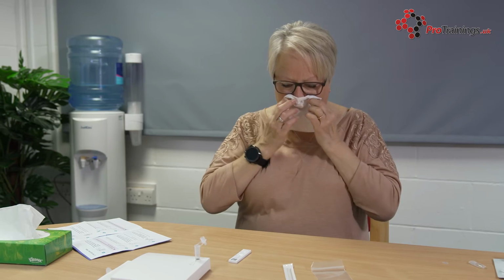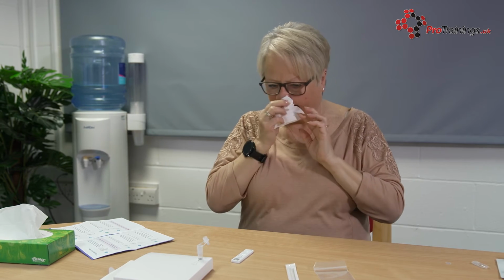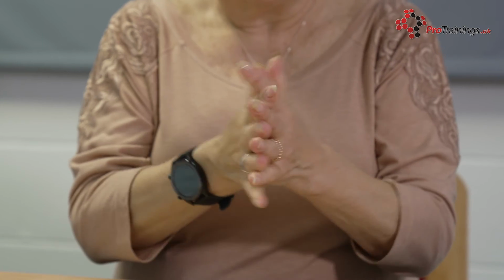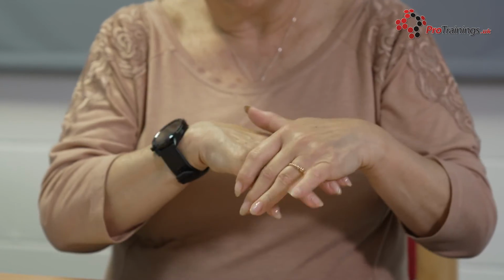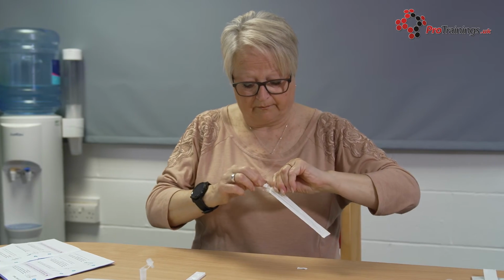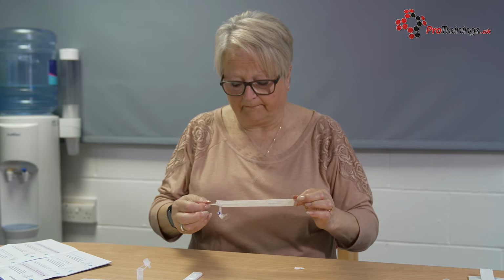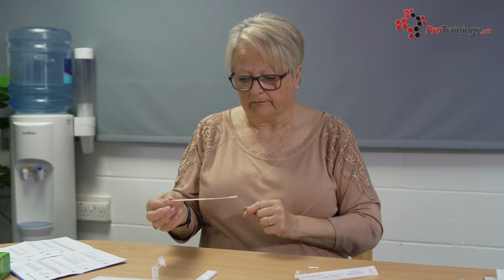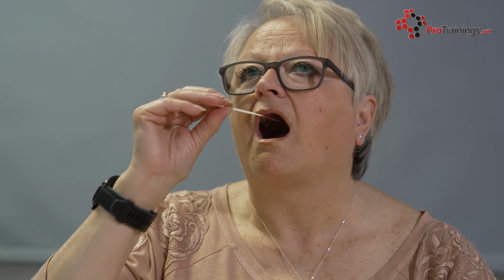Gently blow your nose into a tissue and then throw the tissue away into a bin. Wash your hands again for at least 20 seconds or use hand sanitizer again. Pick up the swab and open it when you're about to take the test and take it out of the packaging. Do not touch the soft fabric tip of the swab with your hands.